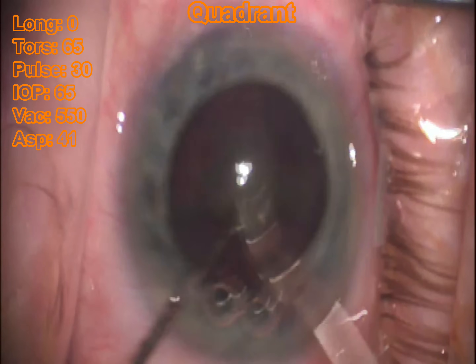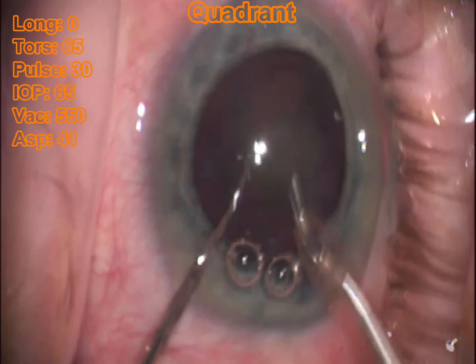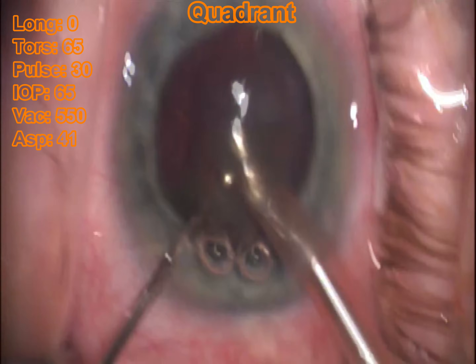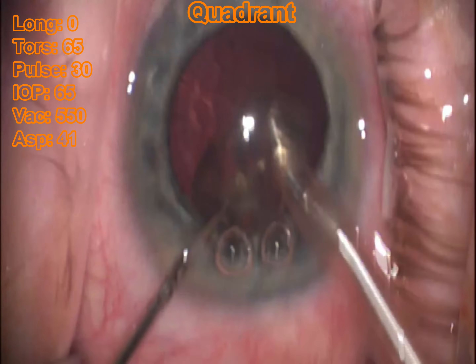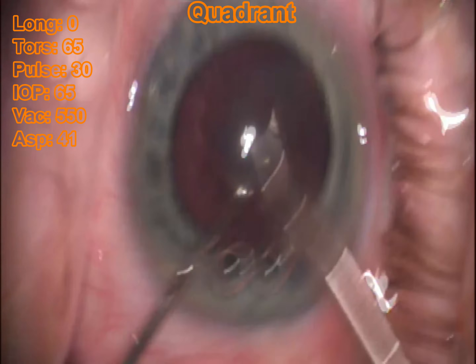As you can see here, each quadrant — I dip that Connor wand underneath that lens and pull it up to myself, and I'm not having to dive down with the FACO handpiece into the danger zone. I like to keep that FACO handpiece right at the iris plane for the entire case, and this technique lets me do that.